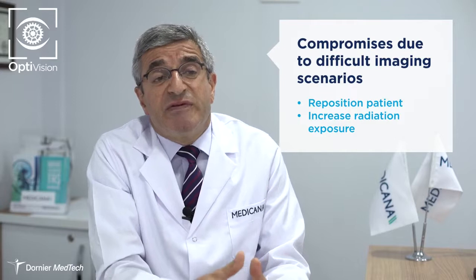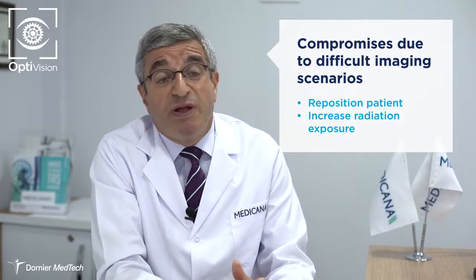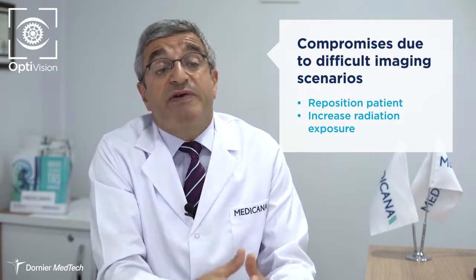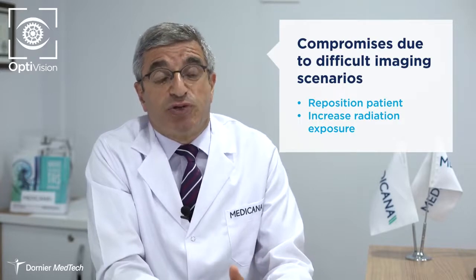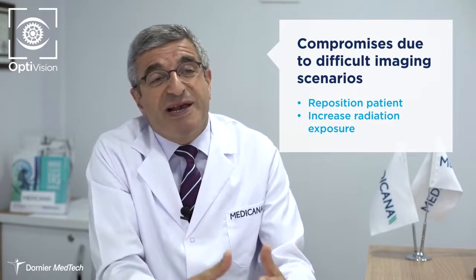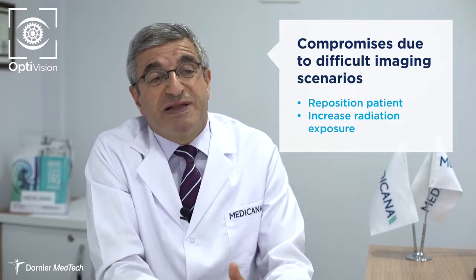What we did, we tried to get rid of the bowel gas by moving the patient, changing his or her position. Also, we tended to increase the level of radiation in order to have a good image quality, but it will bring high radiation exposure, danger for us and for the patients. But these are classical tricks we applied in order to overcome these difficulties during imaging.